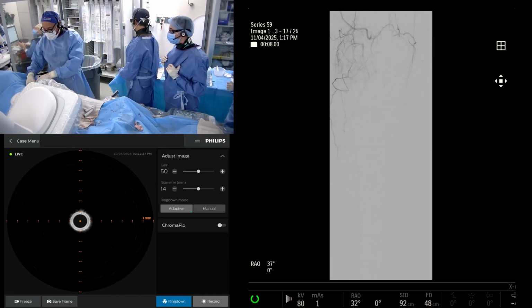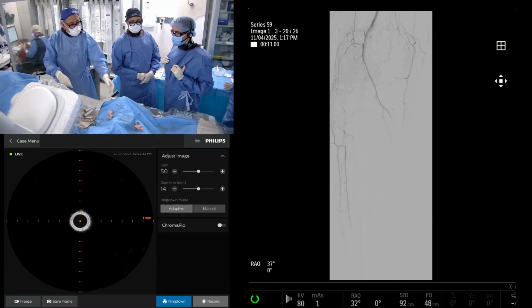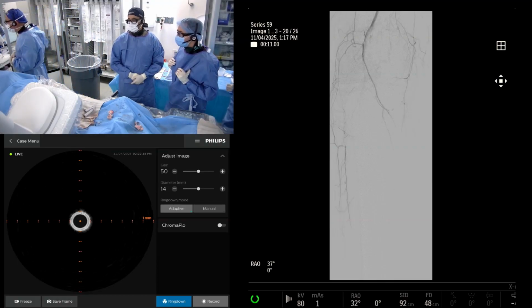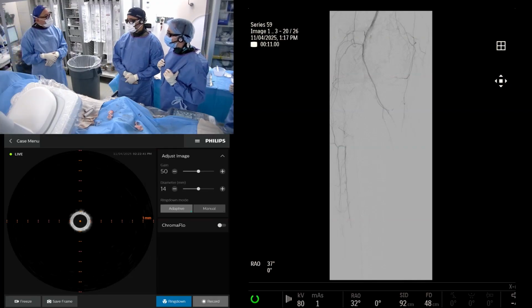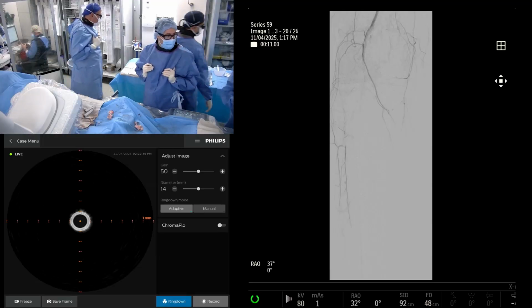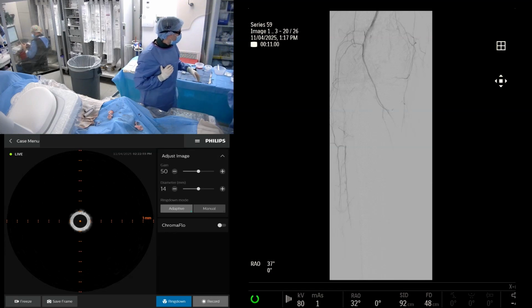Do you want to get the Lightning 6? Can't be the Lightning. It has to be the 6. Is there a 6 Bolt? I don't think there's a 6 Bolt. So which one are we in? There's a 6 EX, which is the rapid exchange. Isn't that the Cat RX? Do we have that? It's upstairs. You want me to go up and get it? Probably, yeah. Either that or you take the neuro catheter. If you take the ACE, which has no angle on it. Actually, neither does the Cat RX. I prefer the Cat RX, wouldn't you? Yeah.